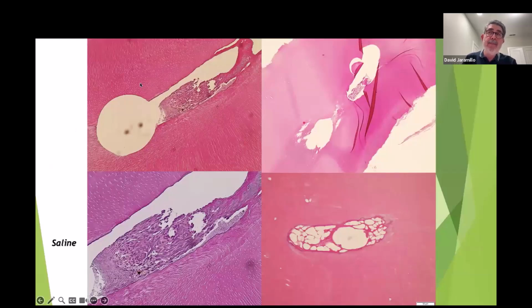The root canal normally is clean. We have no problem cleaning the root canal. But where we find those fins and those isthmuses is where that 35-40% of the root canal wasn't touched.